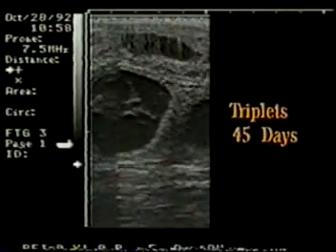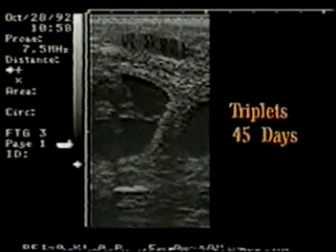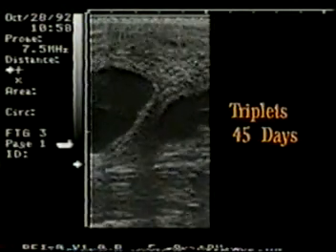Occasionally, triplets are diagnosed by ultrasound. All three of these have a healthy heartbeat. They were the result of a donor cow not being flushed, based on the ET practitioner palpating only one corpus luteum on flush day.